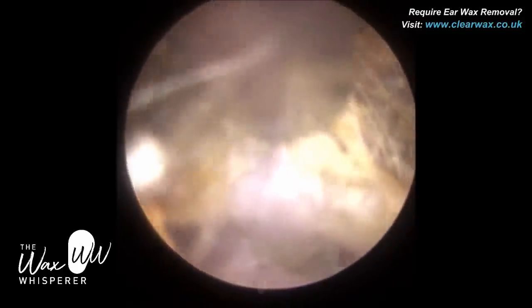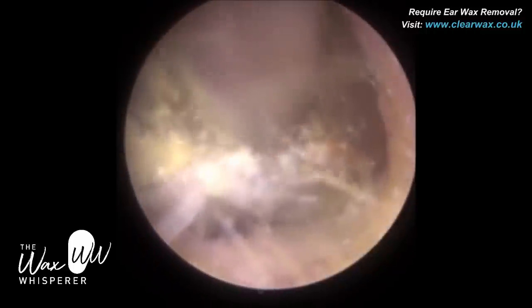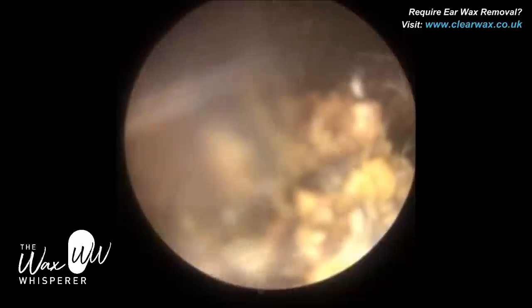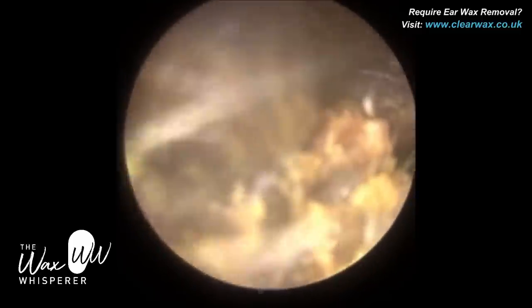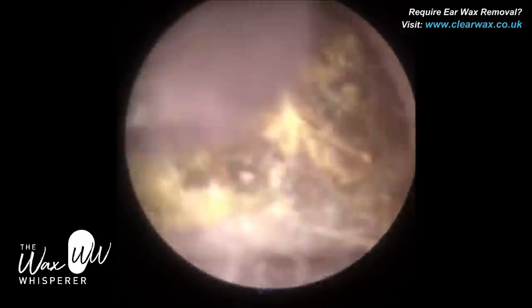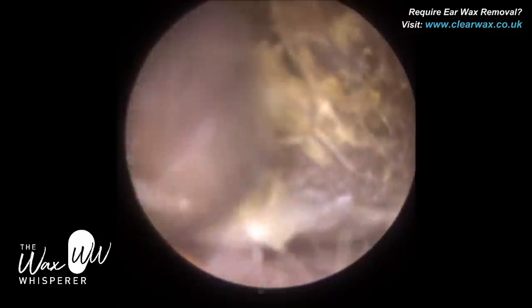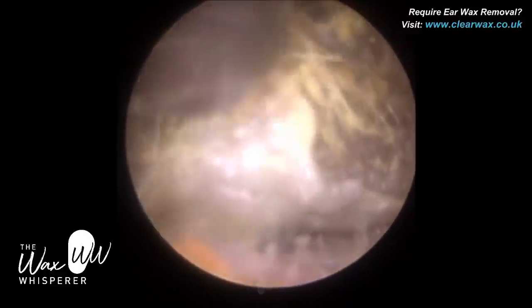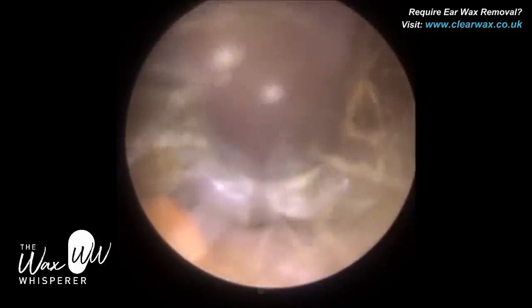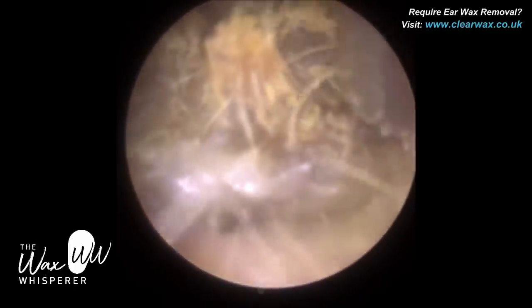You can see here I'm lifting it off the base of the ear canal. You can see a thin layer of keratin — some dead skin that's also adhered to the wax. We're just on the posterior canal wall. When you've got a wax of this consistency, it's quite difficult to vacuum. I call this the clay type of wax. I did use an ear hook as well, and you can see that just slides straight through. So what I'm trying to do is manipulate this wax, trying to mobilize it by detaching it and elevating it from the canal walls.